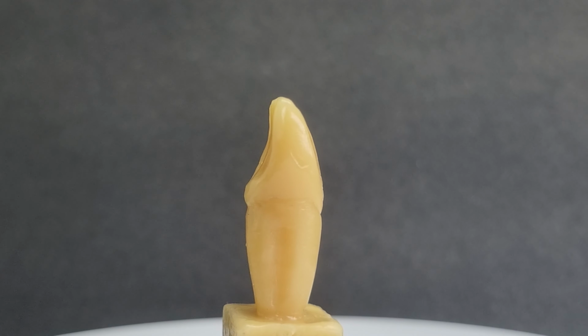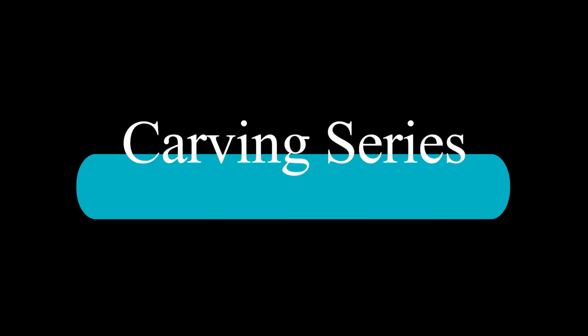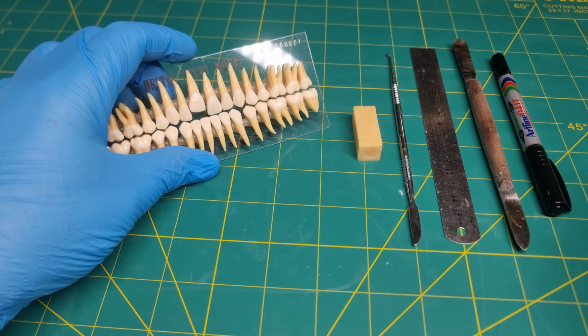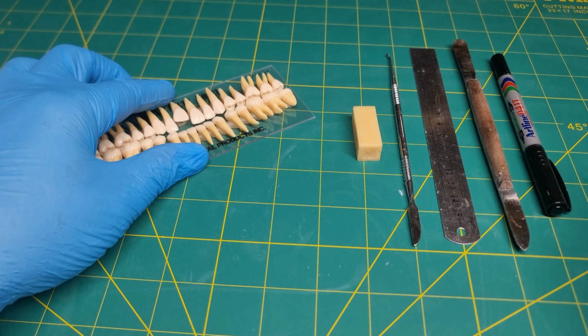This process involves creating an accurate representation of the tooth's anatomical features, essential for dental students and beginners. In this video, we'll be teaching you a basic carving method for the maxillary central incisor with some useful tips and tricks for carving. So students, grab your tools and let's get started on this dental masterpiece.